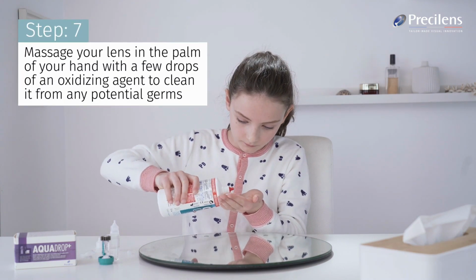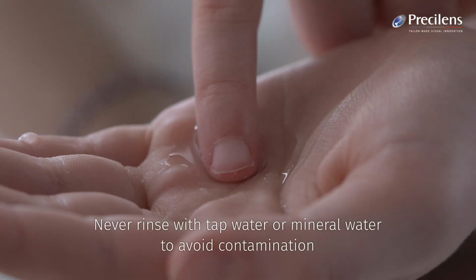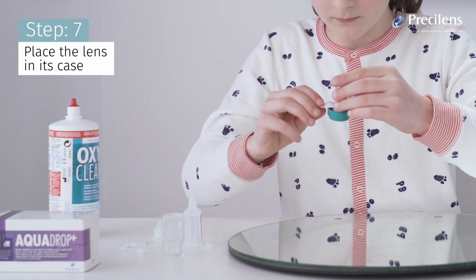Massage your lens in the palm of your hand with a few drops of an oxidizing agent to clean it from any potential germs. Never rinse with tap water or mineral water to avoid contamination. Place the lens in its case.